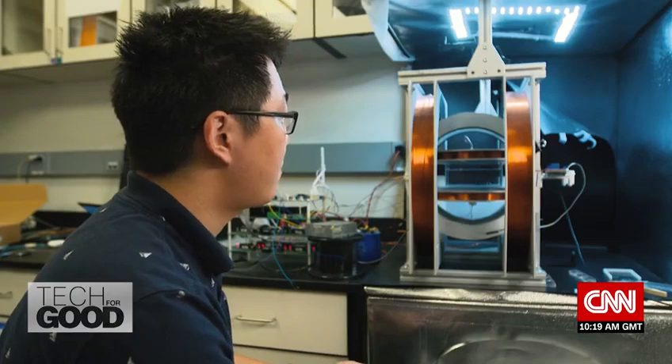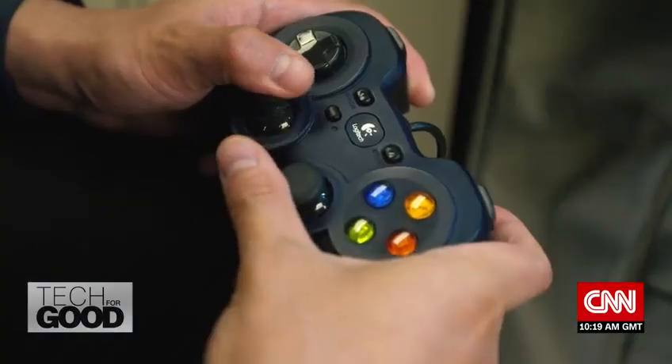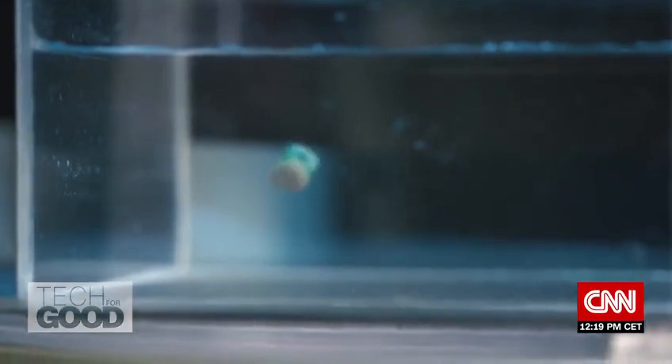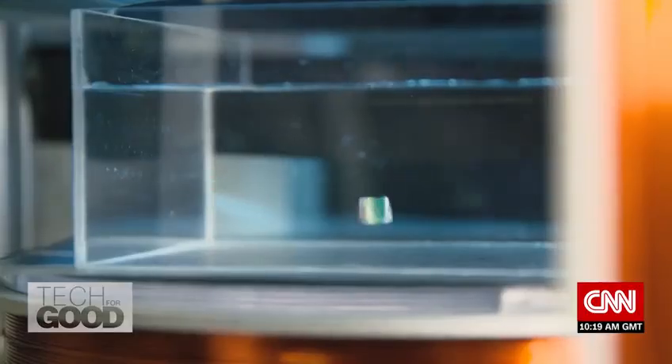Once inside the body, technicians are able to manipulate the robot using a magnetic field. The very nice thing about this design is that we only use one set of magnetic fields, but just by changing its magnitude and direction, we can selectively control the unit that we want to move.